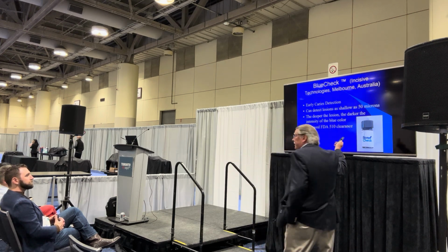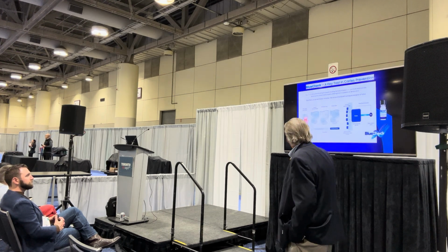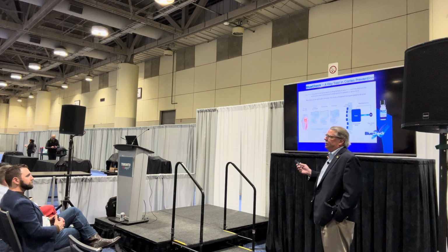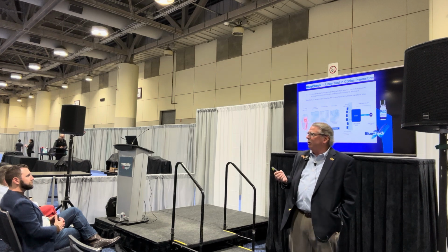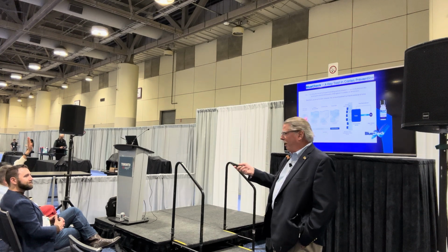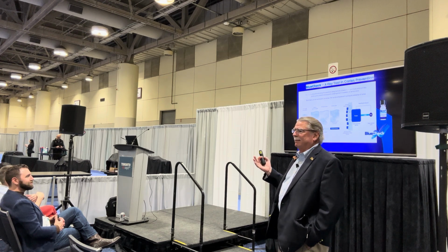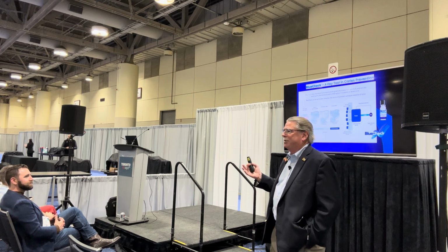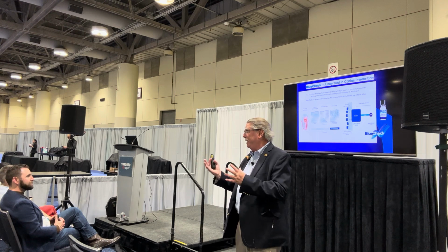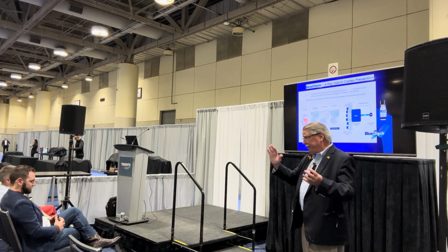So this is through Incisive Technology out of Melbourne, and the whole idea, like I told you, is you put this stuff on and it goes into demineralized enamel. And if you came from the University of Iowa, or University of Texas, San Antonio, in research, we don't talk demin as a casual thing. We always talk about it as pore volume, because as it demineralizes, you get greater pore volume. And you want to catch it before the pores get so big they break away and cause cavitation, right?